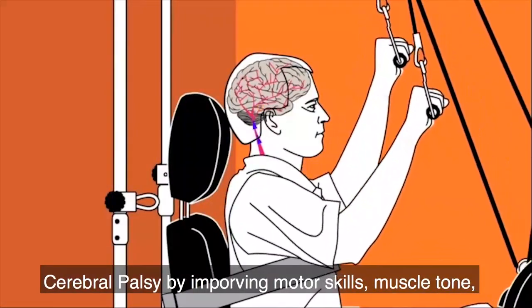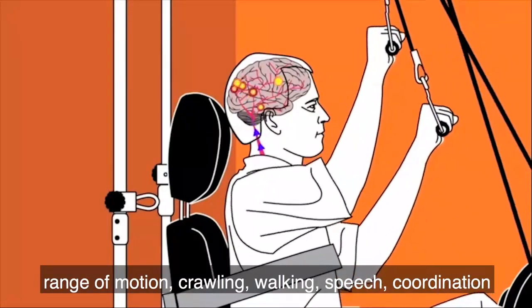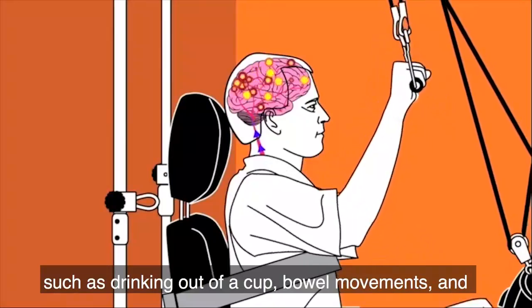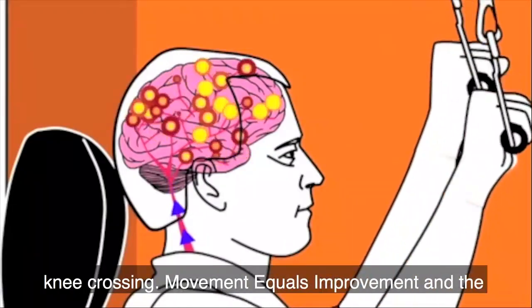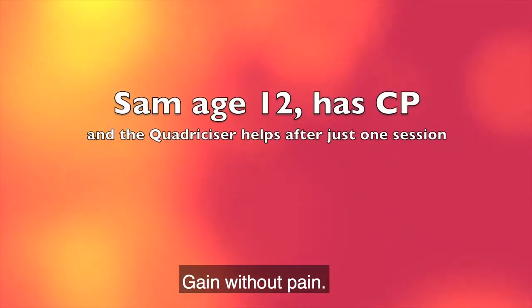This can help cerebral palsy by improving motor skills, muscle tone, range of motion, crawling, walking, speech, coordination such as drinking out of a cup, valve movements, and bladder function. The Quadricizer can also help improve balance and aid in straightening scissors gait with knee crossing. Movement equals improvement, and the Quadricizer gives you therapeutic movement gently — gain without pain.